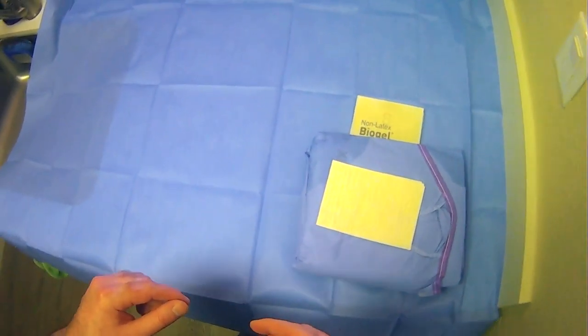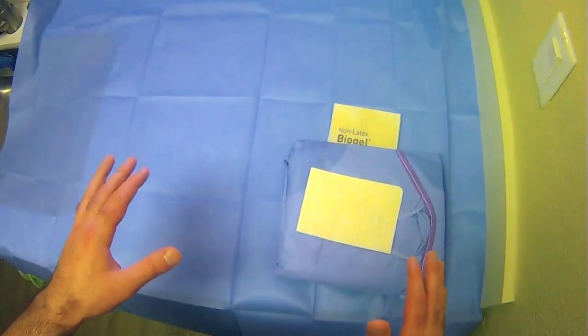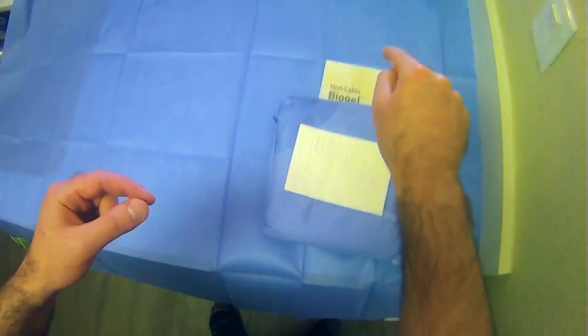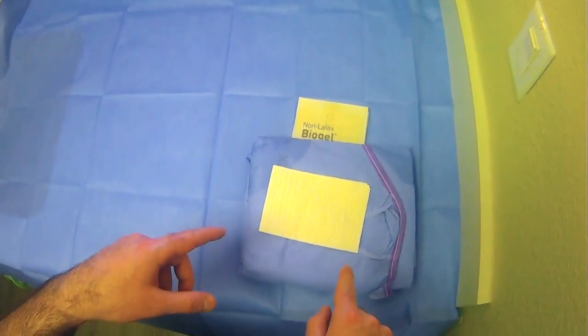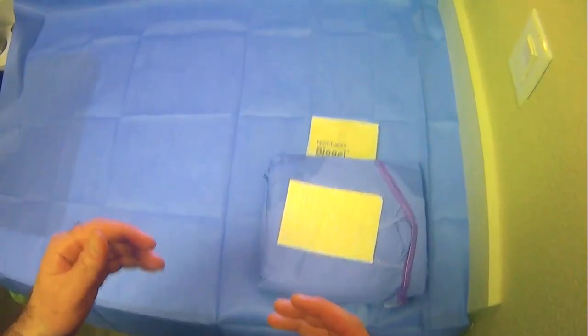In a previous video, we discussed how to set up your gown and gloves on a sterile surface to prepare for scrubbing in. And this is essentially where we left things, where we opened our sterile gloves first, and then placed our sterile gown above it without contaminating the field. Now what we need to do is actually scrub into the case.